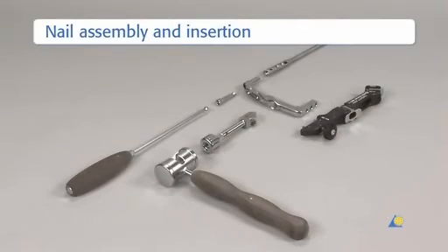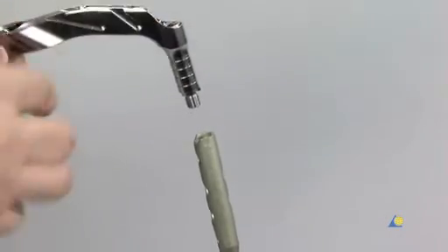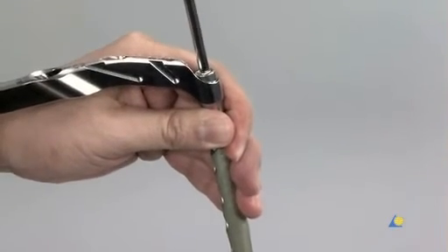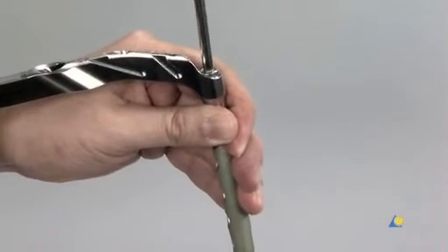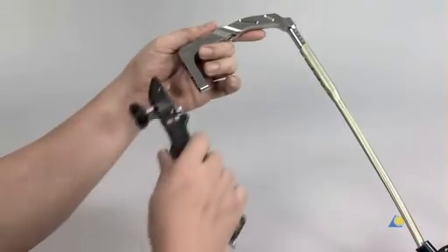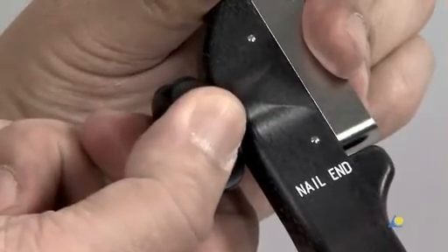The instruments needed to insert the nail and prepare for recon locking are: the hexagonal screwdriver with spherical head, the cannulated connection screw, the insertion handle, the appropriate A2FN, the connector for the insertion handle, the combined hammer, and the aiming arm. The insertion handle is connected to the nail with the connecting screw using the hexagonal screwdriver. It is important that the tongue of the insertion handle matches the notch of the nail. The aiming arm is connected to the insertion handle before the nail is inserted to verify that it will guide the hip screws correctly through the nail.